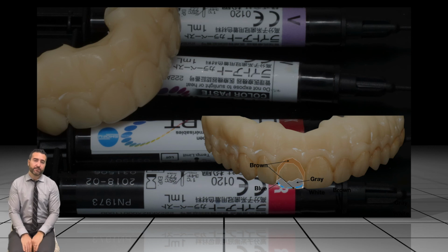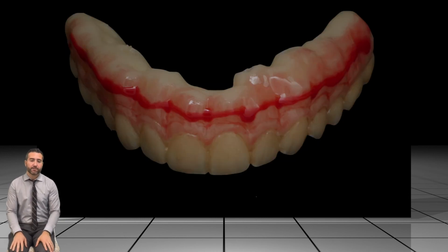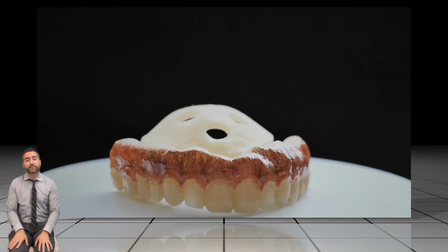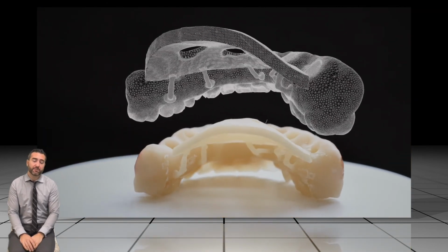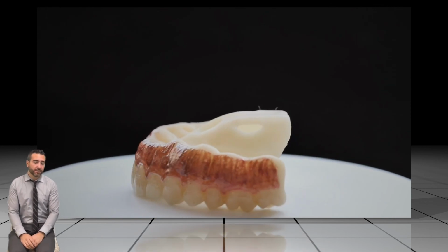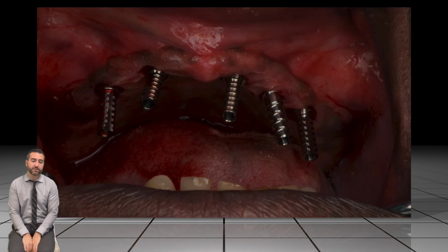in the market to be able to add pinks and various different colors to the 3D printed materials to really make them pop and turn lifelike and aesthetic. Many different types of stains coming on the market that are phenomenal. What's more important is there's new materials coming on the market that make 3D printed stronger than milled, as far as it relates to acrylic, PMMA, and resin nanoceramics. So look for that. There's some exciting stuff, especially from some key leading manufacturers on the laboratory side, and Vision Tech has some extremely strong materials coming out that you're going to be able to use.